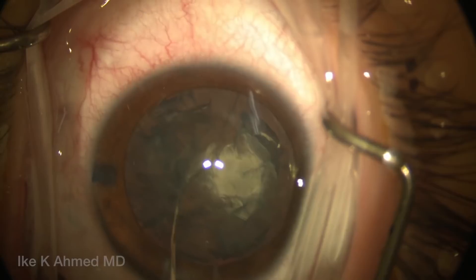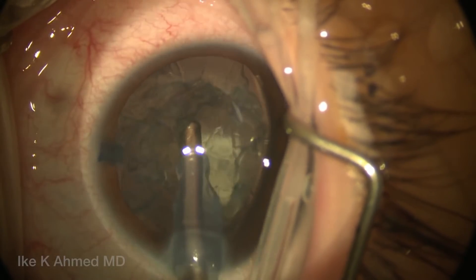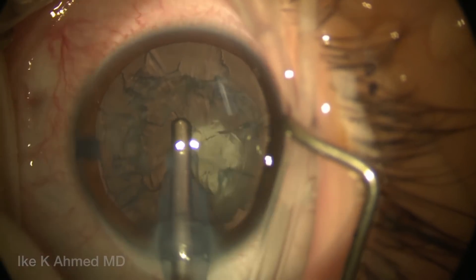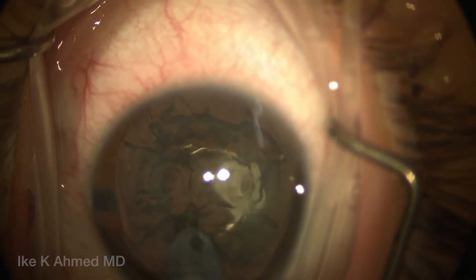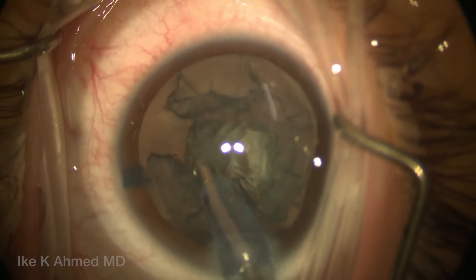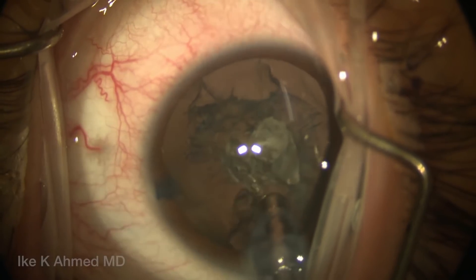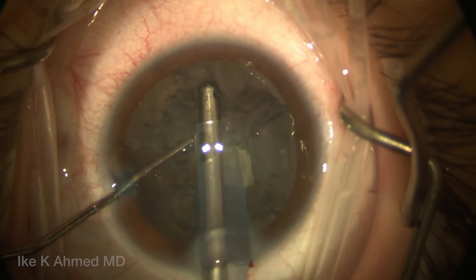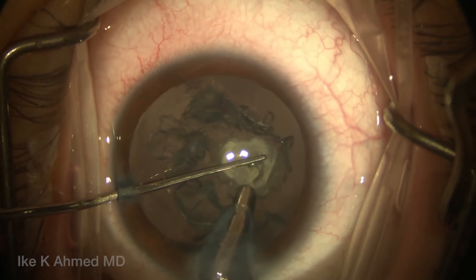We're going to do hydrodelineation to separate the endonucleus from the epinucleus. This will help us to remove the central endonucleus first, followed by the epinucleus. This being a soft lens, we're going to use the irrigation-aspiration handpiece to first remove the central endonuclear zone, and then chipping away, removing the epinucleus 300 degrees around the periphery, avoiding the central plaque, leaving that until the end.